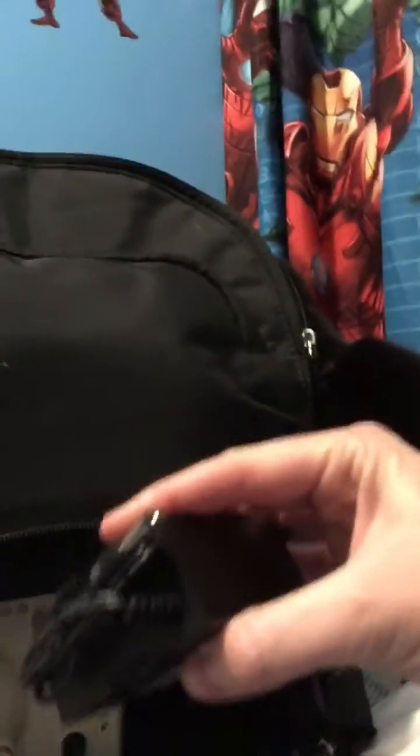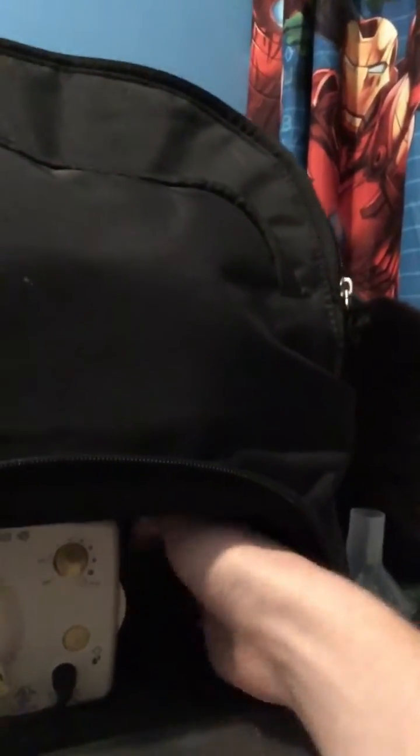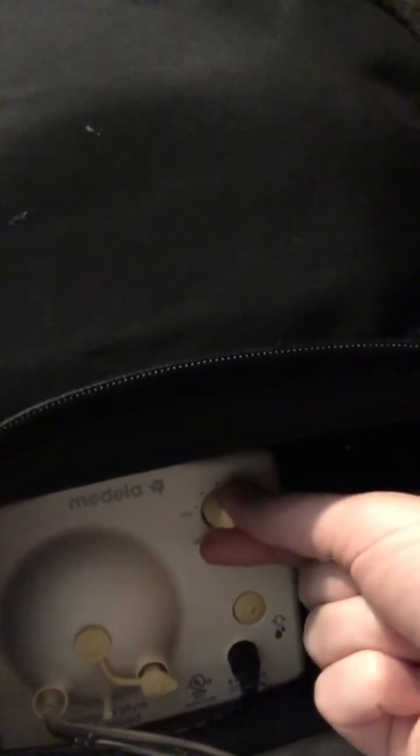So when you go to start your pump, one, you want to make sure that the power cord is plugged in, which is this black piece right here. Most pumps come with a power cord. Some of them also come with a handy dandy car charger, so this actually just plugs right into your car, so you can pump in the car on the go. And then to turn your pump on, you have a little yellow knob in here. That is this piece right here. And what you want to do is turn it on just like that by twisting it.